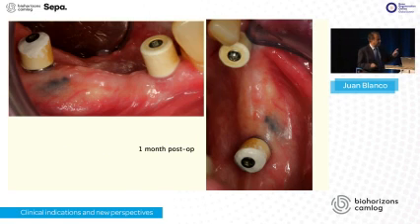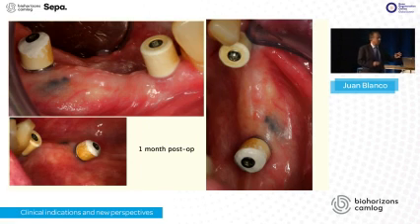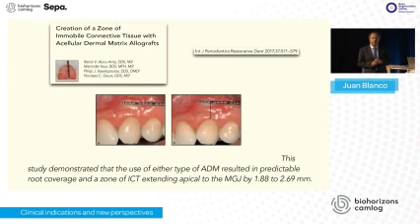We can see also the lingual aspect where we have almost also a very nice keratinized tissue around the implants. And according to this paper, I want again to pay the attention for you and take a look to this important clinical aspect. Sometimes we don't see keratinized epithelium in the mucosa, and we immediately think that this mucosa is going to be mobile. But according to this paper, this kind of matrices has the property of increase the immobile connective tissue beyond the mucogingival line.